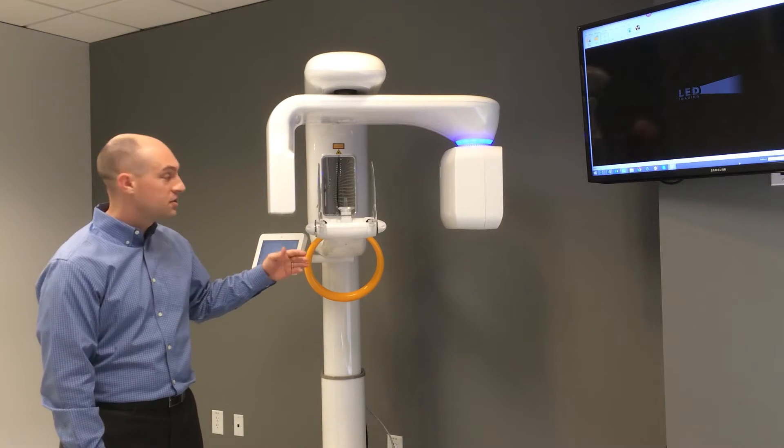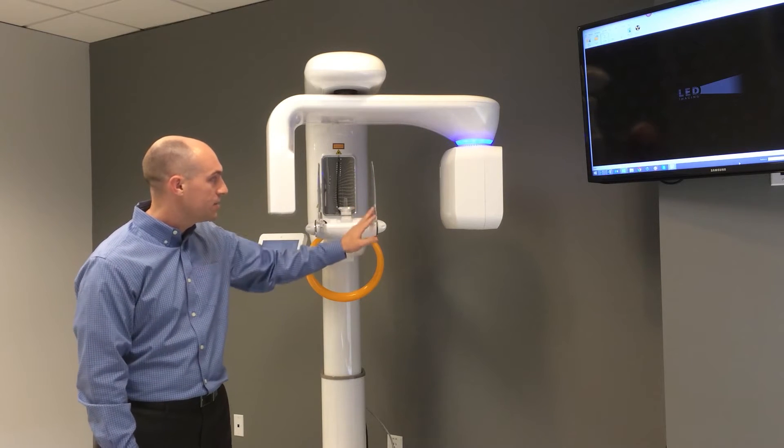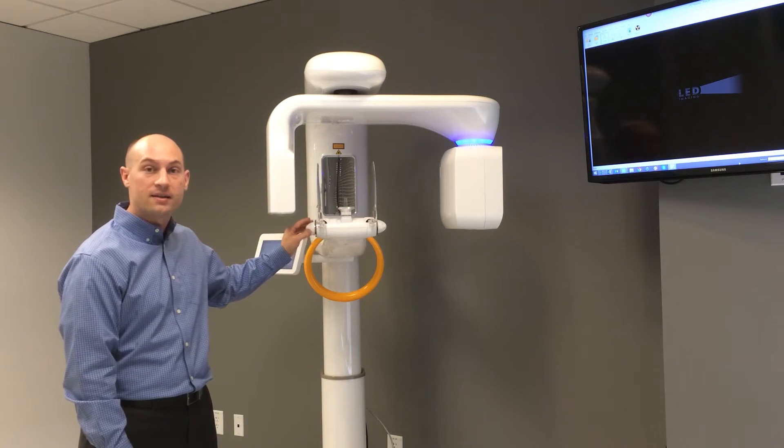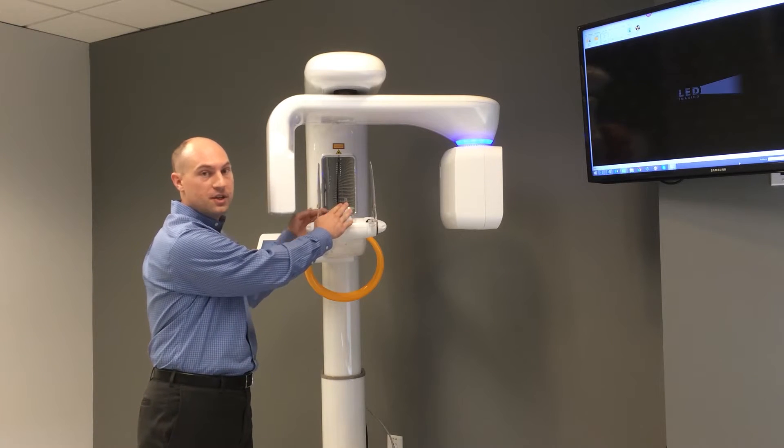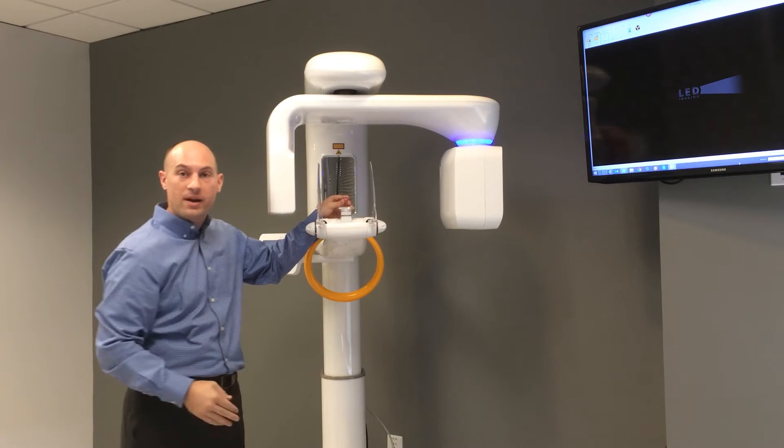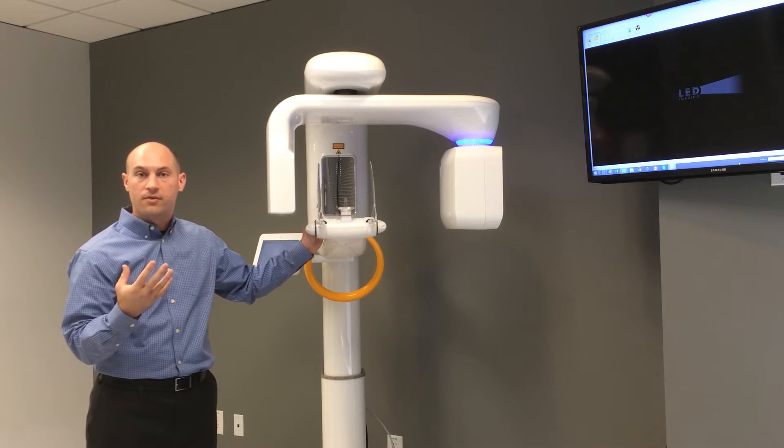Where the patient would be positioned is right here, where we have temple supports that can be turned and tightened in and out once the patient is inside the machine. We have the chin rest where the patient would rest their chin, as well as the bite stick that they would bite onto to make sure they're in the focal trough of the machine.